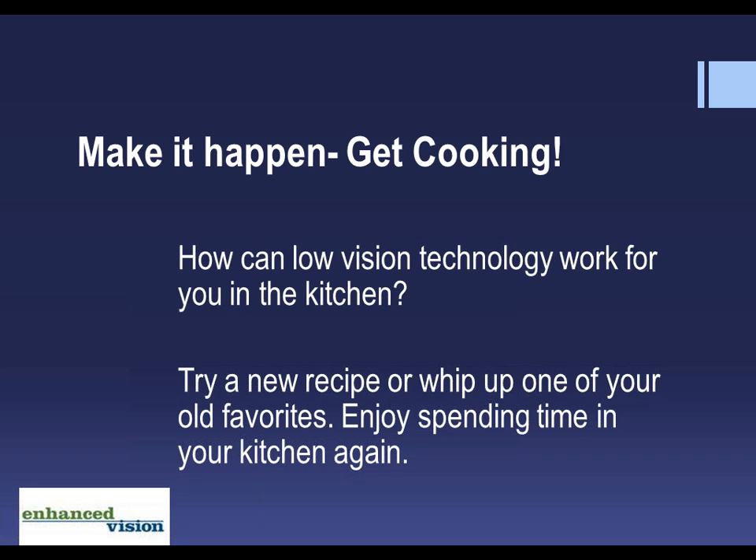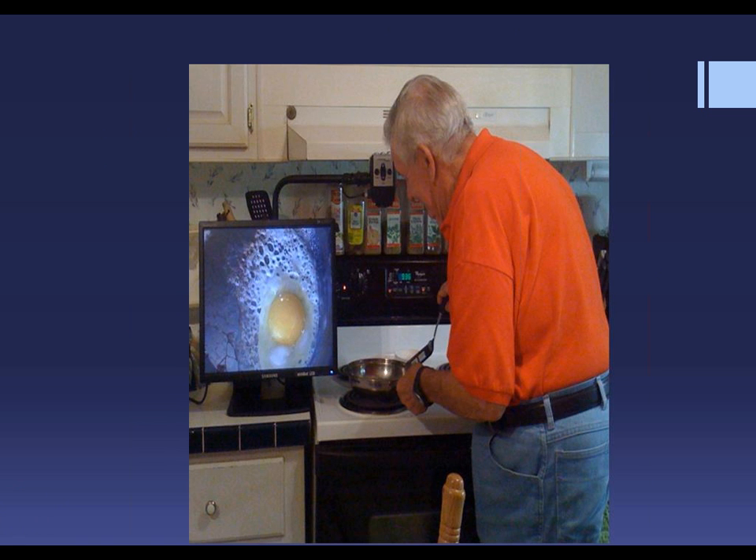How can low-vision technology work for you in the kitchen? Try a new recipe or whip up one of your old favorites. Enjoy spending time in your kitchen again. Today we're going to meet a gentleman named Mr. Hancock. Mr. Hancock has macular degeneration, and he's lost a good portion of his central vision in both eyes, making him very dependent on magnification to help him through the day.